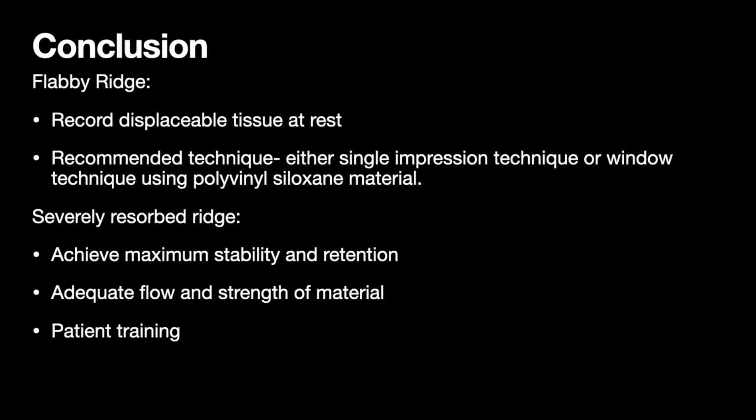For atrophic ridges, aim for stability and retention. Choose materials that capture the tissue's physiological state without overextension, and train patients in proper tongue positioning and denture stabilization. In summary, focus on simple and consistent techniques for reliable results.